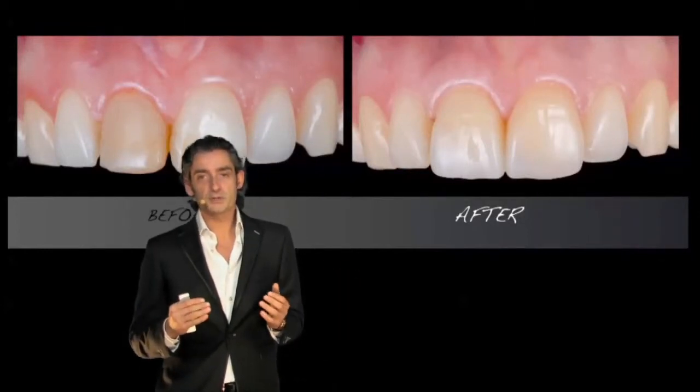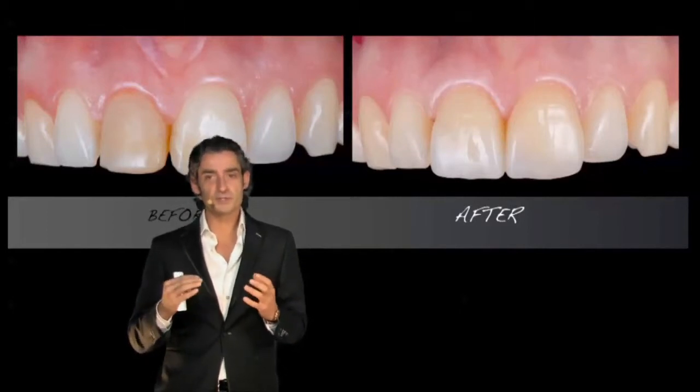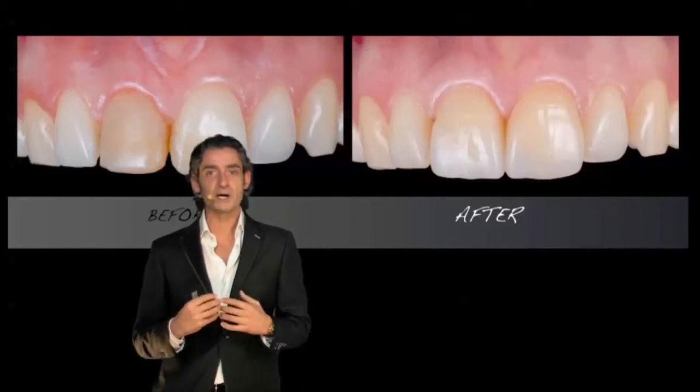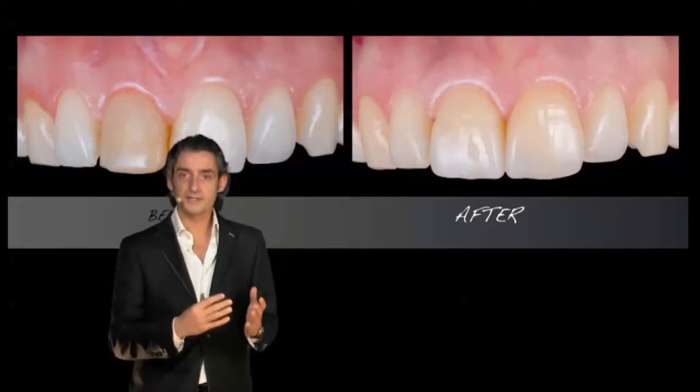Probably there was the need to be really critical and move the free gingival margin more in the apical direction, because we are too coronal compared to the other central incisor, but I have to say that it's a quite nice result considering this kind of technique.